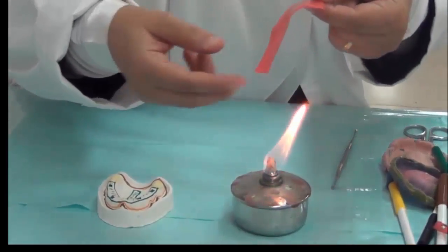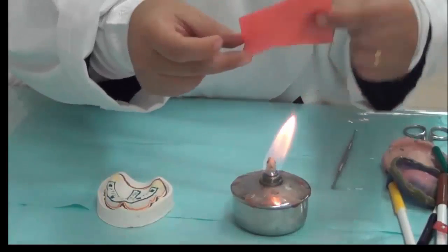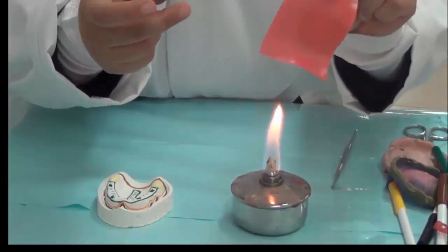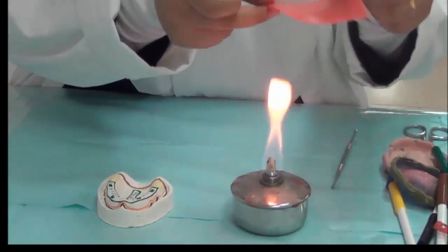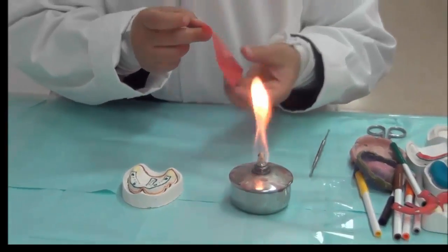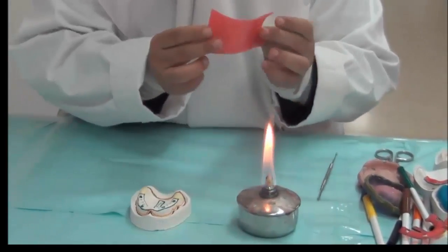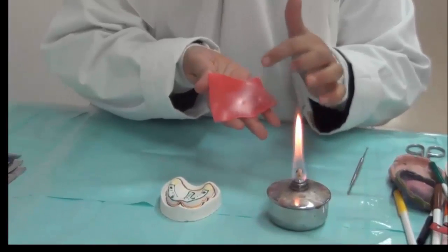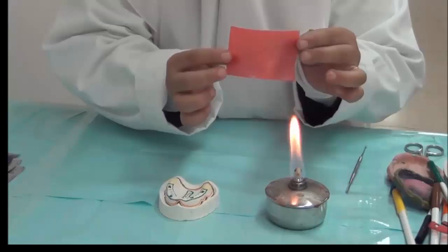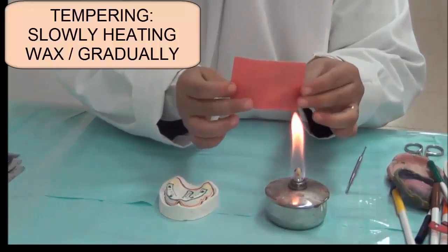We heat the piece of base plate wax until it is soft enough that it doesn't hold its weight. You can see that it's going and flowing, and I'm also heating it from multiple sides. This is called tempering, which is slowly heating the material. I don't allow the surface to drip, so the wax on the surface is not dripping. It becomes a bit light in color and pinky.